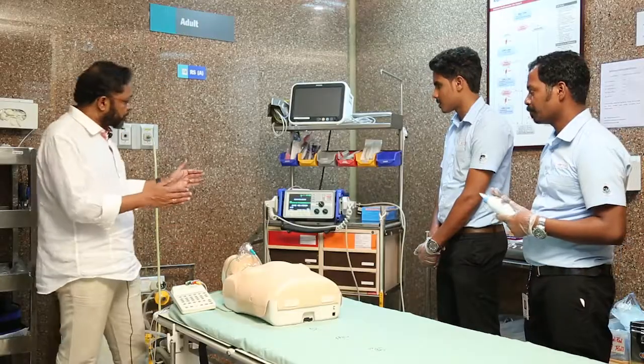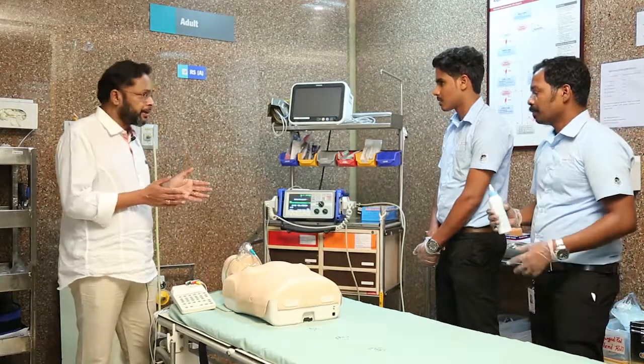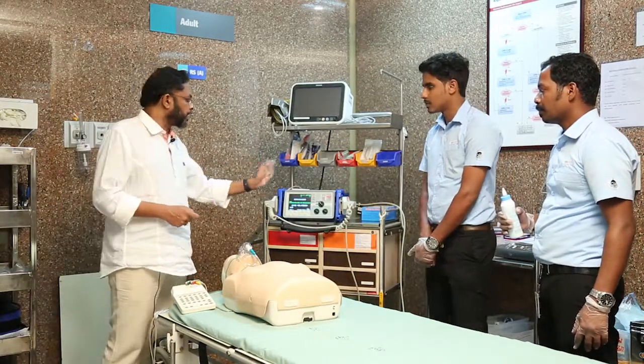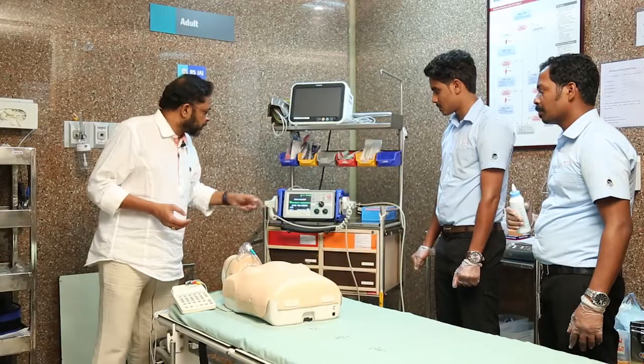The purpose of synchronization is to avoid delivering the shock during the vulnerable period of the cardiac cycle. If the shock falls on the vulnerable period, it can trigger a malignant rhythm such as ventricular fibrillation or ventricular tachycardia.